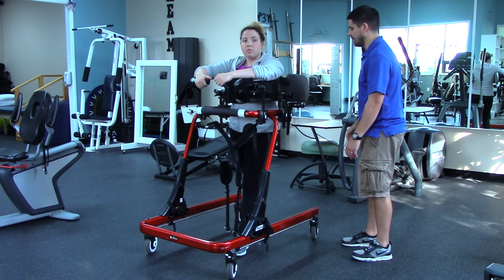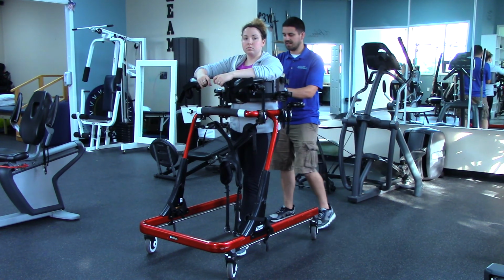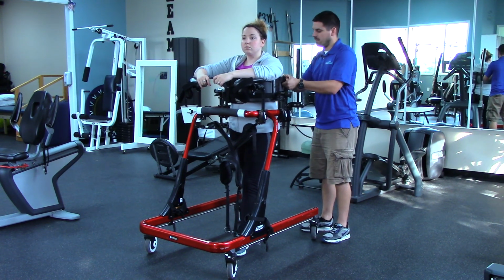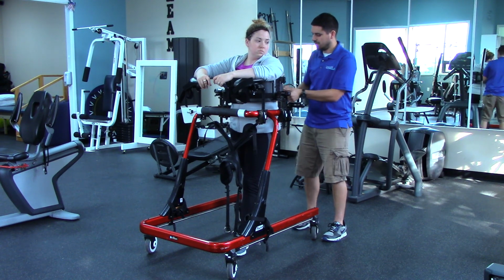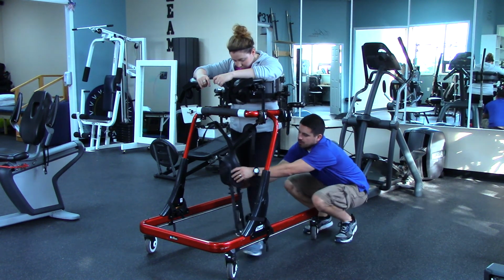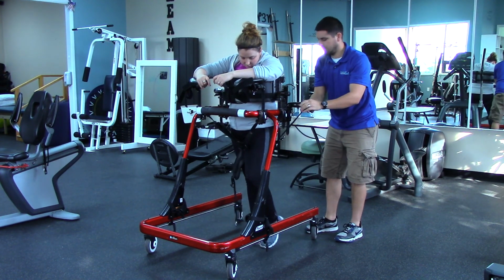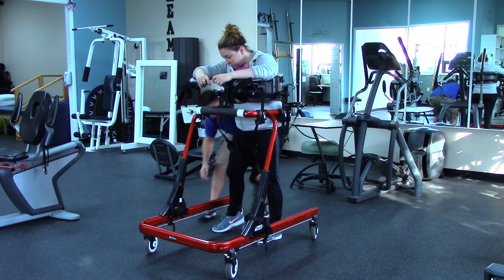So depending on the patient, to me this typically tends to be easier just because you're up top and it seems to be something that's secure to start. So we'll tighten this out first, tighten this one out, and then I'm going down here. I'm going to loosen this out just a tad, and then coming up through here. And we're going to loosen this one out just a tad too, coming up on this side.